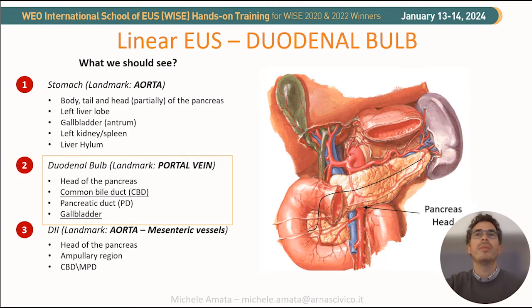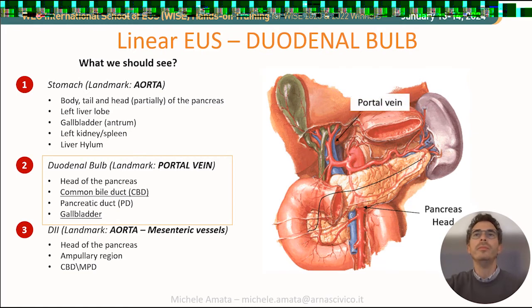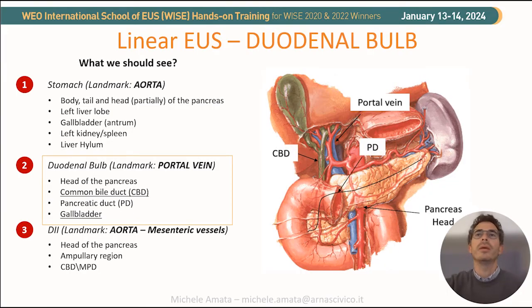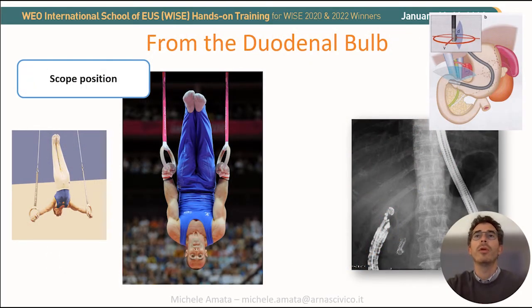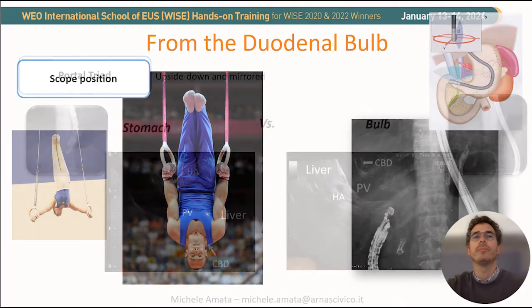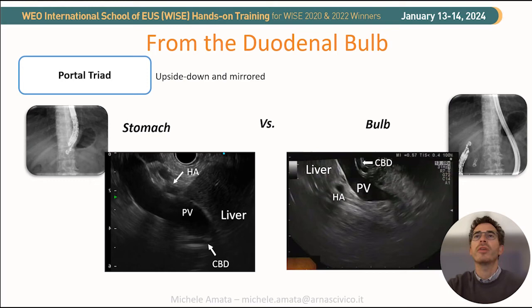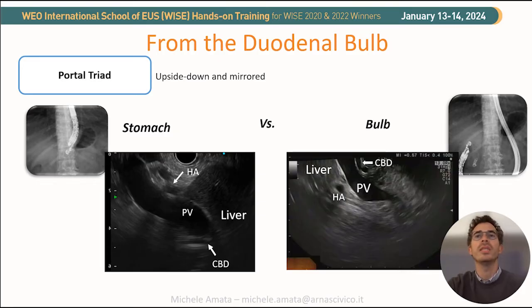From the duodenal bulb, the main landmark is the portal vein. We will also trace the CBD, the MPD, and a small portion of the gallbladder. As you can see in the fluoroscopic picture, the scope long position leads us to inspect the biliopancreatic structure from below — it can be compared to the position of a ring gymnast. As a result, the hilar structures are upside down and mirrored. For example, viewing the hepatic hilum from the bulb compared to the stomach: from the stomach, the liver is on the bottom right, the hepatic artery is closer to the transducer, and the CBD is distal. From the bulb, images are upside down and mirrored, with the liver on the upper left, CBD closer to the transducer, and the hepatic artery more distal.